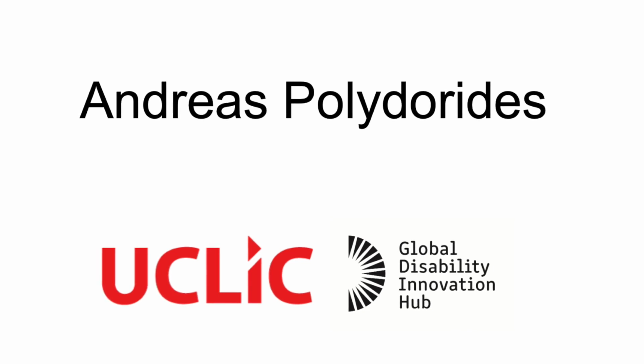The G-code for many of these approaches can be viewed in Slicer software before printing and then sent to the printer to come to life. We will be showcasing example cushions from each of these methods, allowing you to generate your own through the web tool or modifier methods, and see a cushion printing live.